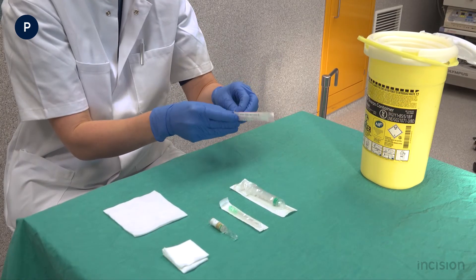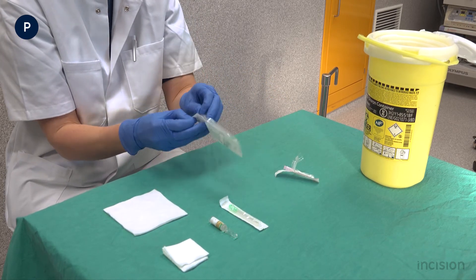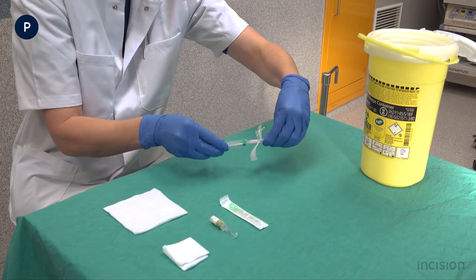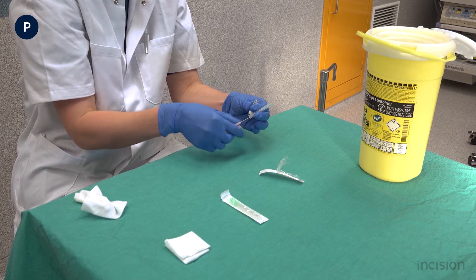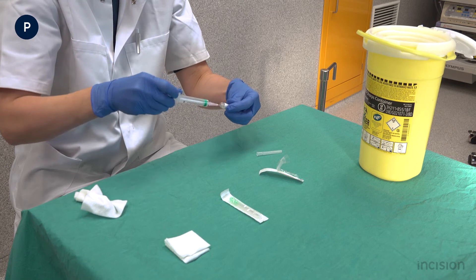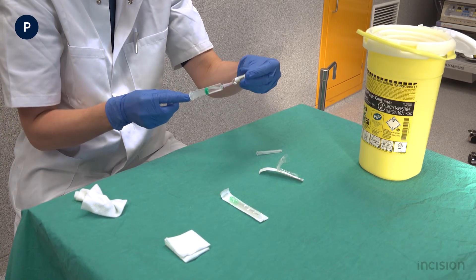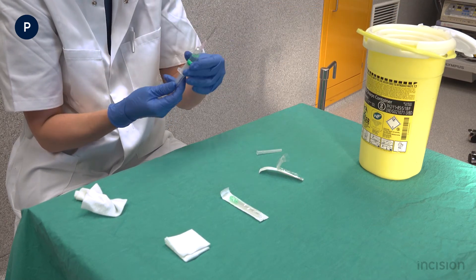Subsequently, the syringe and suction needle are unwrapped and connected. The cap of the needle is removed and with the suction needle the medication is drawn up. Air bubbles are removed by flicking the syringe and pushing the plunger upwards.